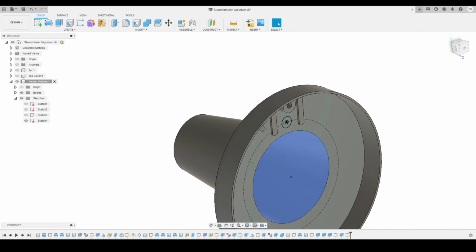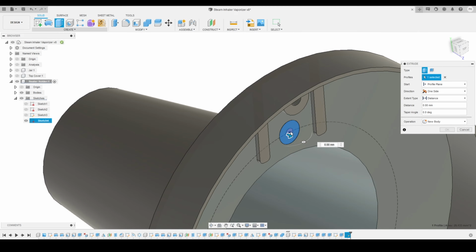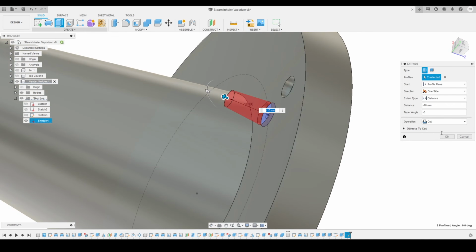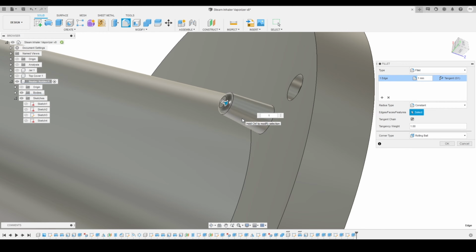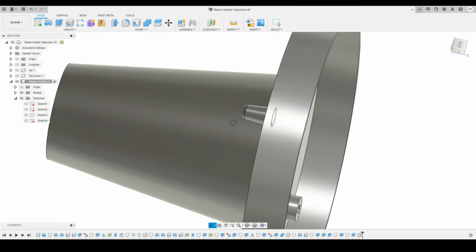Here you can see, and now I will activate my extrude tool, select both the profiles and extrude it towards the opposite direction. And here I will provide the distance first. So this is just 10 millimeter, and I will also give it a taper angle towards the inside, so it will be less in diameter on the extreme side, and I will change that to join. Here you can see. Now I will apply a fillet on this edge of 1 millimeter and press OK. Here you can see that. So this is what we had created.